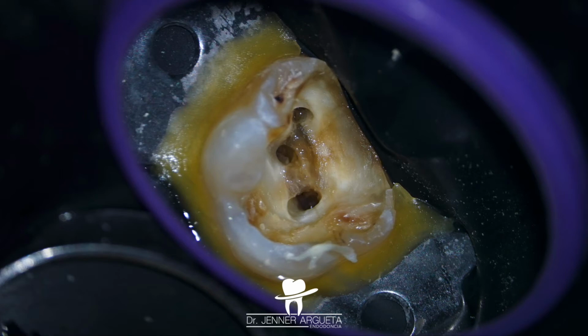I made this mistake in this treatment, but I risk pushing some calcifications inside of the root canals, and we do not want that because it might compromise our treatment. So it's advisable just to locate the entrances of the root canals, remove all the calcifications, and then start enlarging the canals.